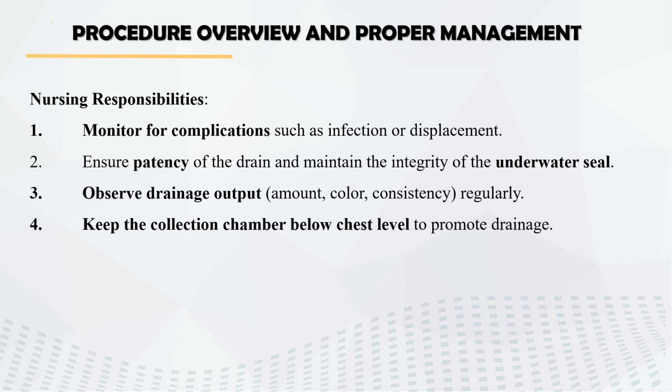In observation of the drainage output, we have to then consider the amount, the purulence, the color, and then the consistency.